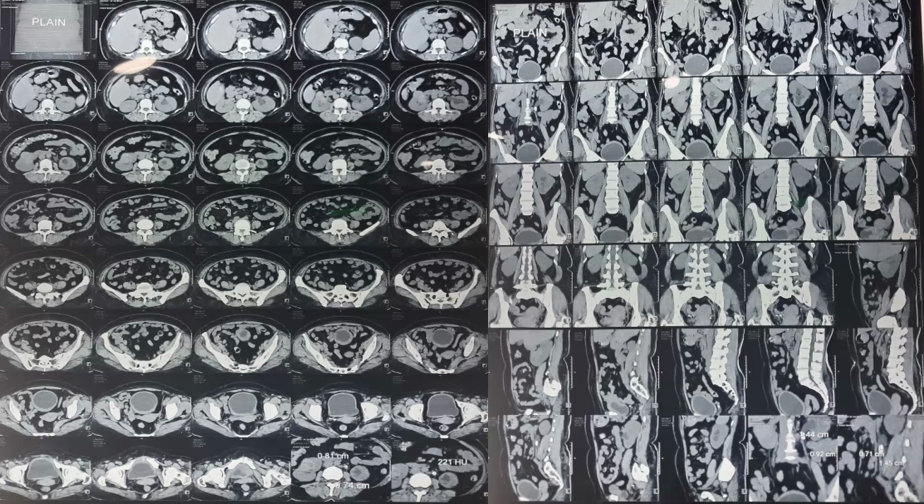First, I explained in the last class how to read the CT scan in renal mass and any malignancy. First is T staging, sir. Whether the mass is, like, size of mass and the complexity of the mass, whether the mass is going beyond Gerota's or not, the adjacent structures are involved or not, and renal vein and IVC are involved or not. In N staging, lymph node status we need to know, and for metastatic workup we need to know the solid organs, and thoracic lung or pleural metastasis. And even bladder, sir. In excretory phase we would like to evaluate the bladder, whether there is any synchronous lesion.